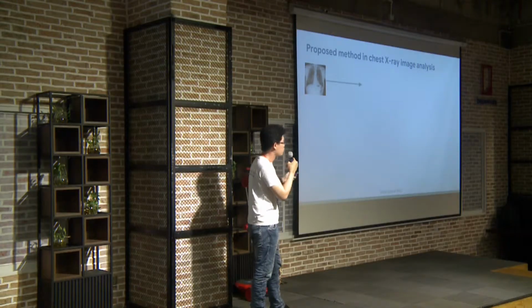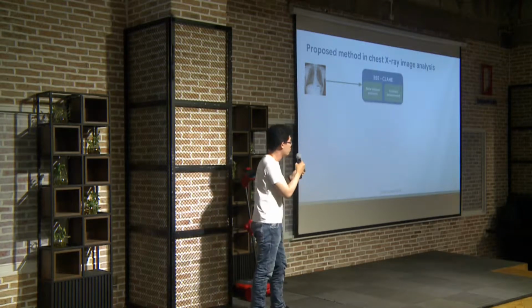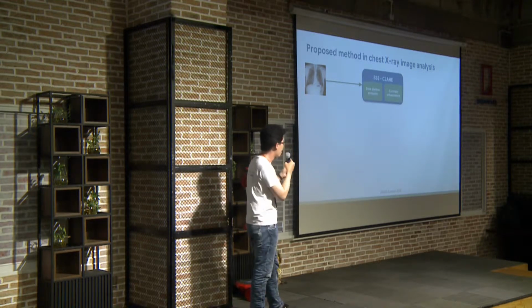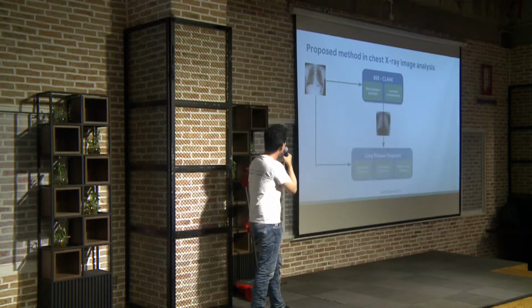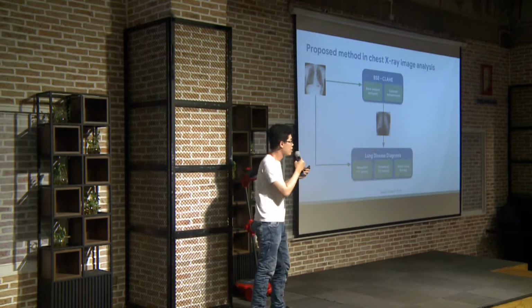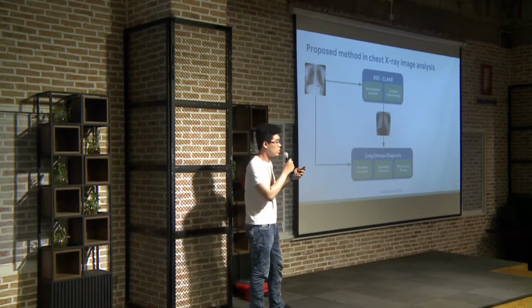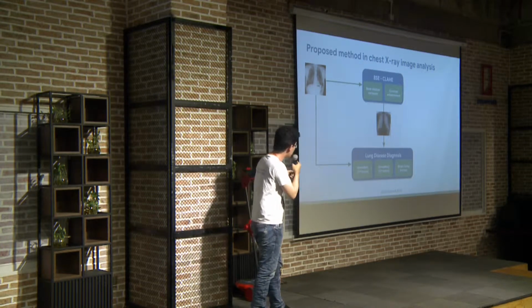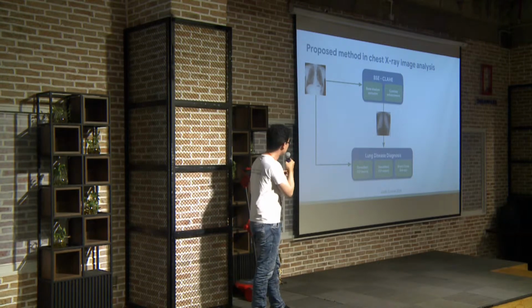With the input as a normal X-ray image, we construct the soft tissue image with the deep learning model and enhance the contrast after that. Then we use both the normal X-ray image and the bone shadow exclusion one to diagnose the disease, actually 14 diseases in the lung.